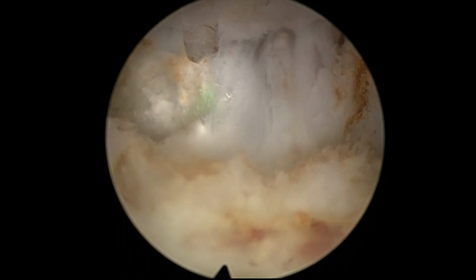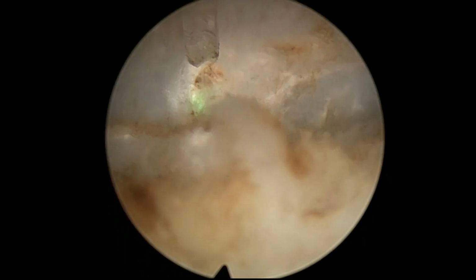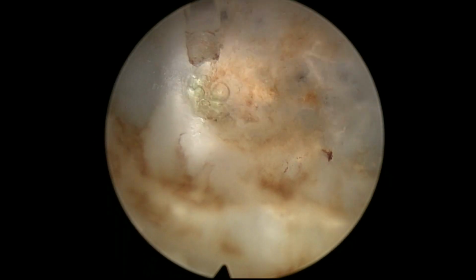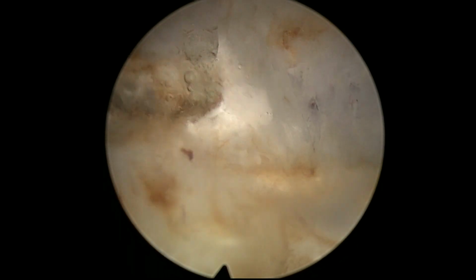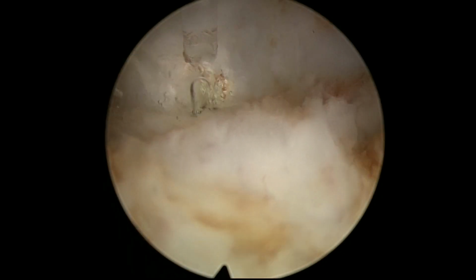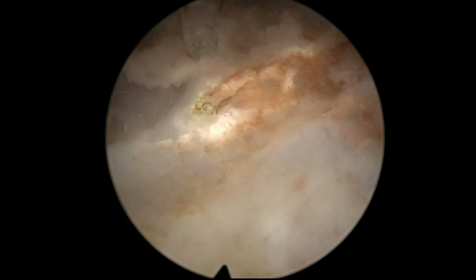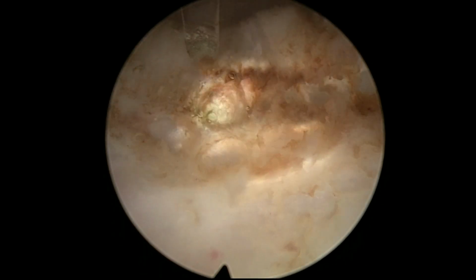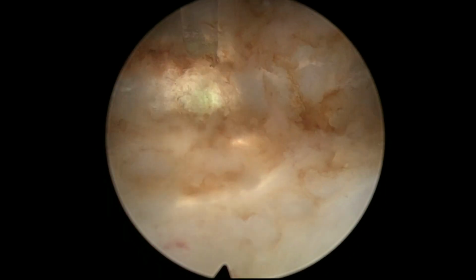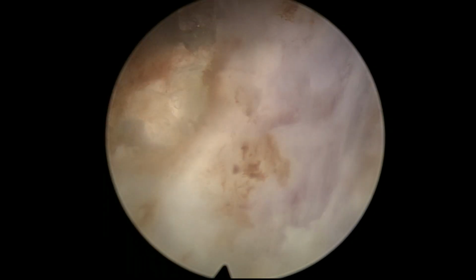And well, it's very impressive also to see, and I hope to post some video, how easily this laser breaks the stones and pulverizes stones. So when you have a combined case with bladder stones and BPH, it's not going to be a problem anymore to work with thulium, because they have managed to provide very nice and very efficient lithotripsy. Here, for example, I am trying to correct and investigating a little bit to see if this plane, if we left a little bit of tissue there. So I don't mind digging a little to find out.